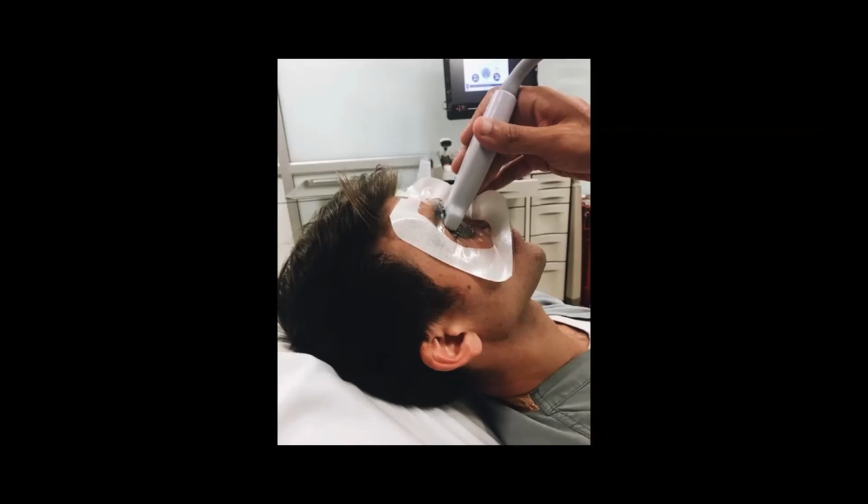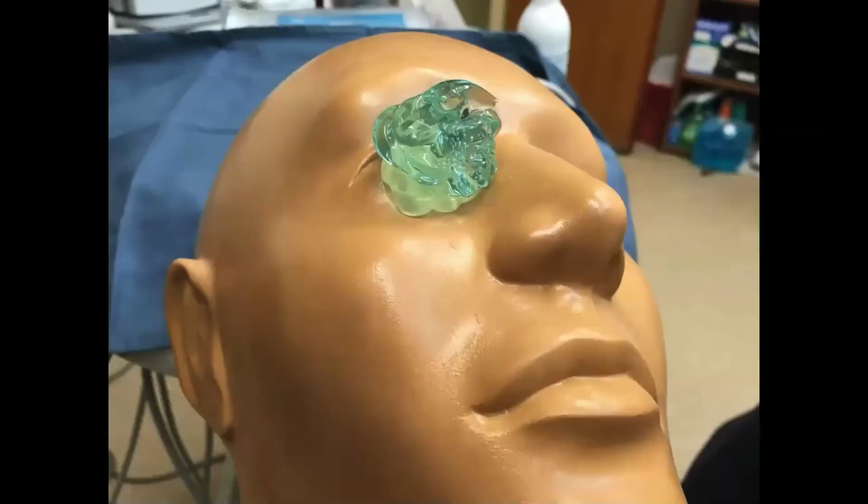Regardless, once you put the Tegaderm down or not, you definitely want to use a copious amount of gel. This is not the time to skimp and save and try to make budget for the year. What you're really wanting to do is fill that orbit up so that you can have a little standoff pad and glide your ultrasound transducer right over that pad to really minimize the amount of pressure that you put on the eye itself.